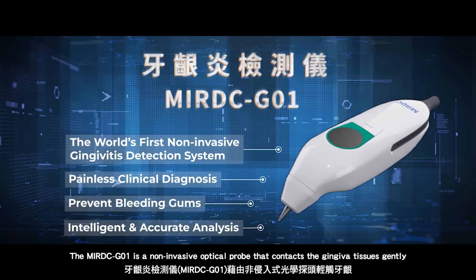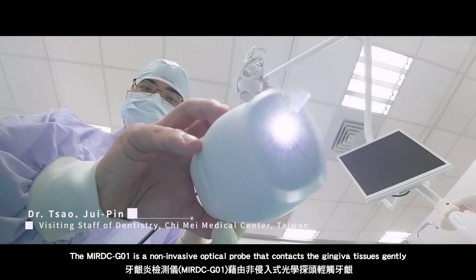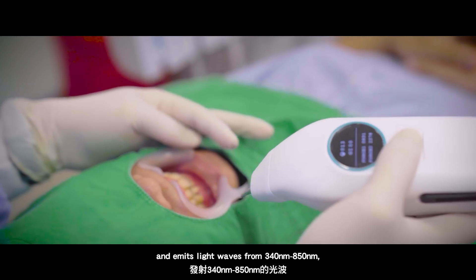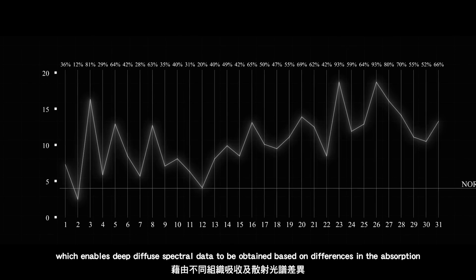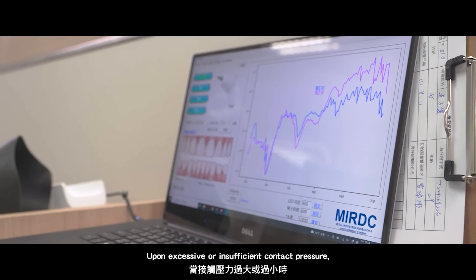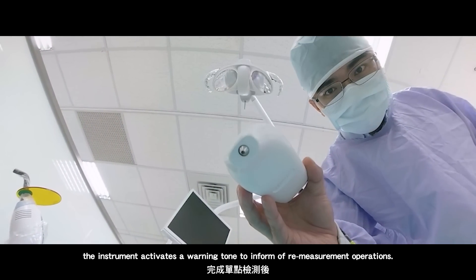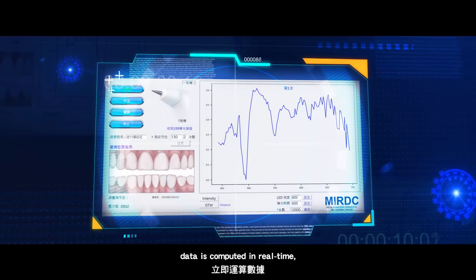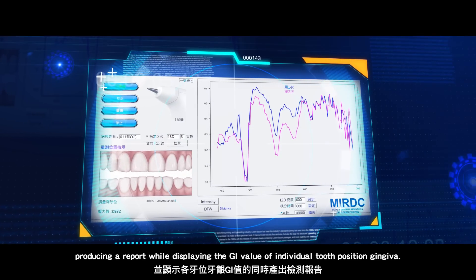The MIRDC-G01 is a non-invasive optical probe that contacts the gingiva tissues gently and emits light waves from 340 nm to 850 nm, which enables deep diffused spectral data to be obtained based on differences in the absorption and scattering spectra in the tissues. Upon excessive or insufficient contact pressure, the instrument activates a warning tone to inform of re-measurement operations. Upon completion of the single-point inspection, data is computed in real-time, producing a report while displaying the GI value of individual tooth position gingiva.